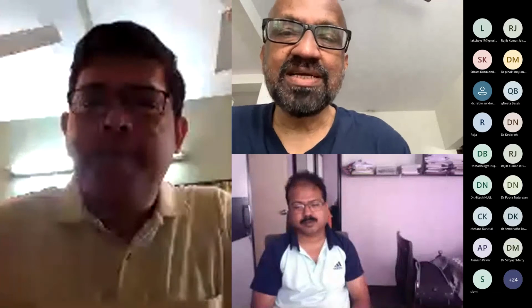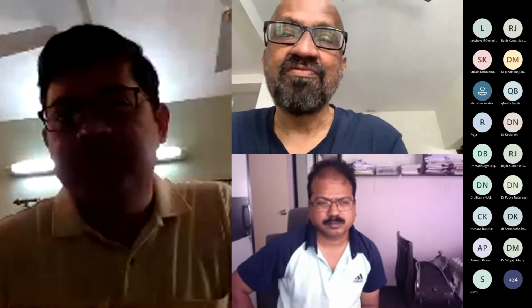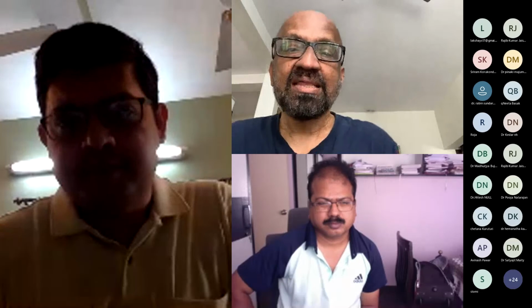Thank you, Arup. Very nice presentation. If the patient arrests with LVAD, the first step is to check the LVAD function, whether it's performing normally, and sort out the pump-related problems, and then look into other issues like RV failure or hypovolemia.